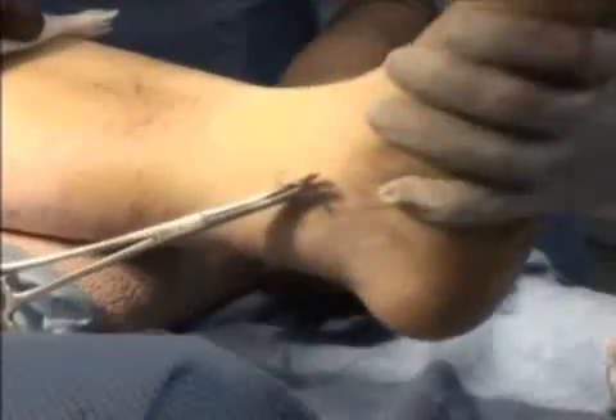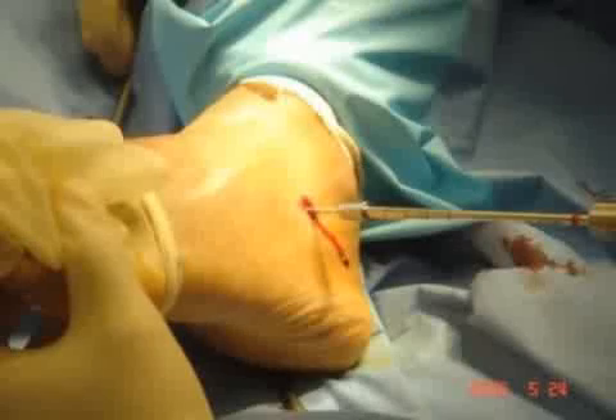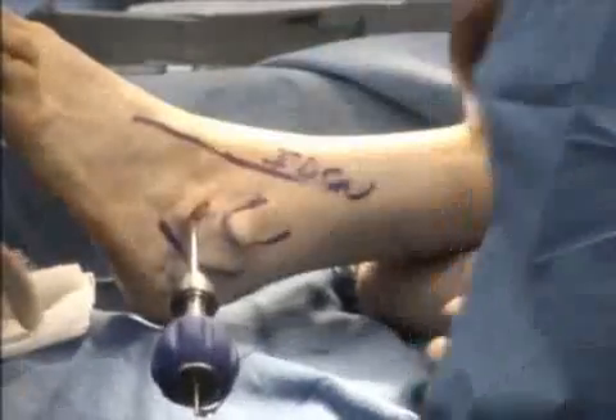Once the guide wire has been established in the proper direction within the tarsal canal, it's a good idea to assess the subtalar range of motion and get an appreciation for how much extraneous eversion the patient has. We'll start sizing the implant by placing the actual sizers over the guide wire through the tarsal canal. It starts with size 7, and if you see too much excursion with size 7, you can start sizing up to the next size, which is 8.